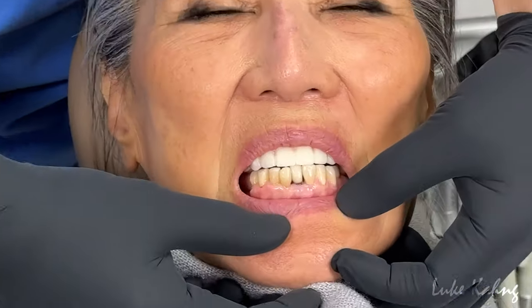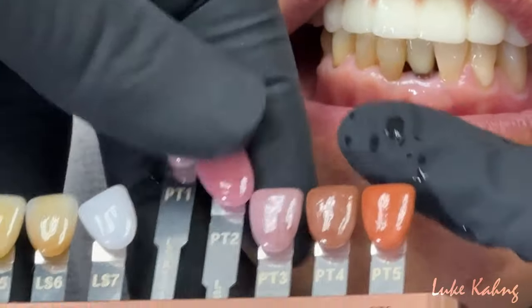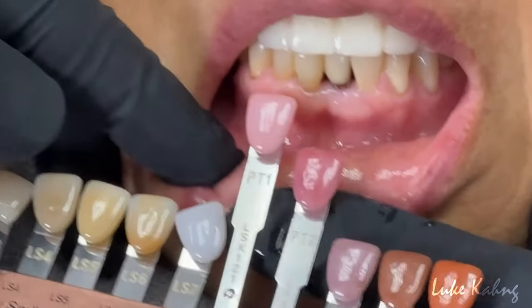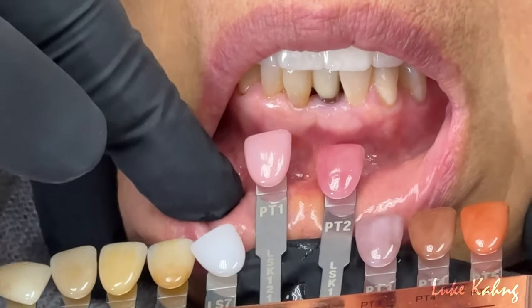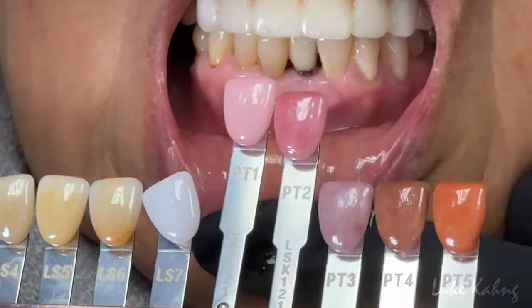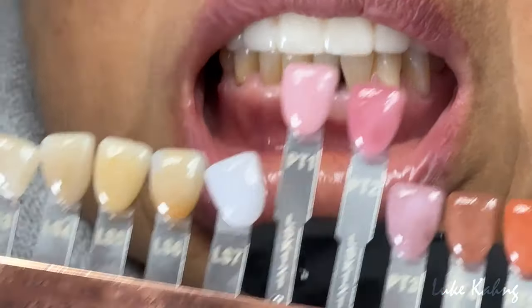I love it. So we see the gradation of color. And then also I can check the color, it will be good. You see the color? That's pretty good. So there's a lot of components in between the teeth, especially PT1 and PT2. That was cool. So I'm going to take the shot and then make the teeth a little bit shorter, bring it in, and pretty good. Okay, now the color, that one, okay.